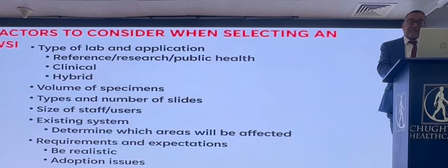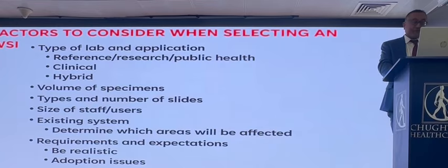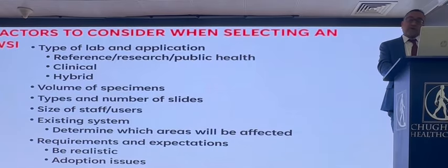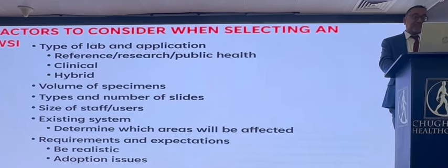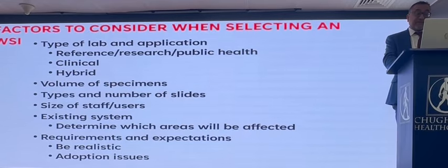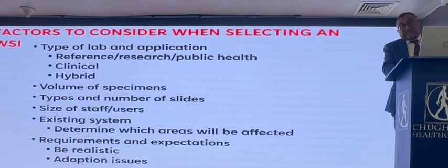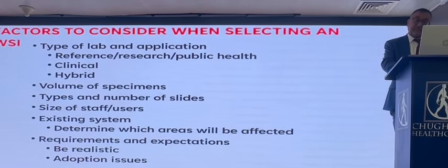Size of the staff? Are you going to have a dedicated person to scan the slides, or are you going to train someone? Are you going to use an existing system and try to replace the lab information systems? So you have to be very realistic. You have to be brave. You have to deal with all these adoption issues.